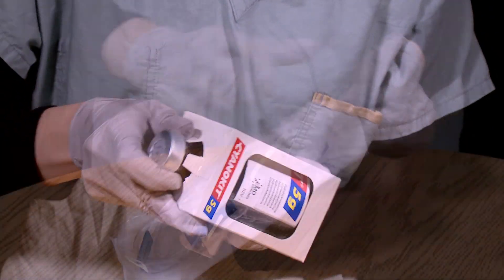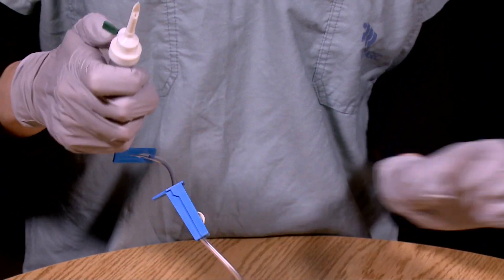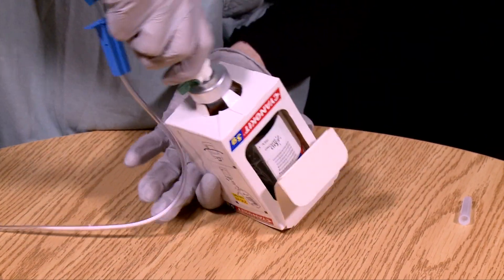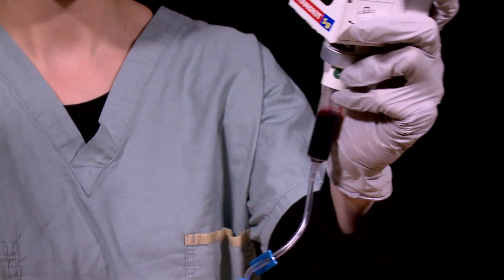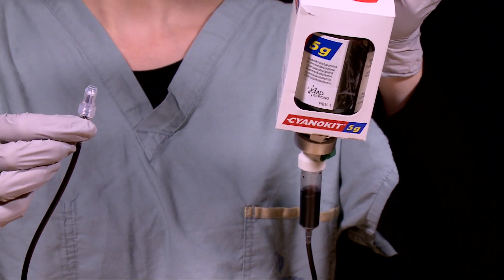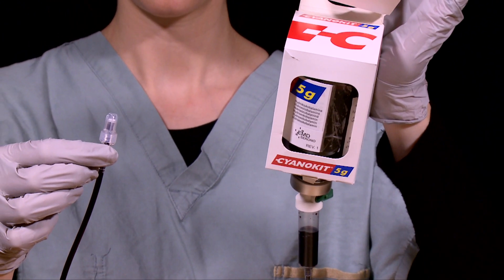Return the reconstituted vial of hydroxocobalamin to the cardboard box that had surrounded the vial. Remove the sterile intravenous infusion set from its packaging and, using the infusion set's intravenous spike, spike the rubber stopper of the vial. If possible, try to use the same entry site used during reconstitution — this will help prevent leakage from the site used with the double-sided transfer spike. Fill the tubing from the infusion set with the reconstituted solution. You are now ready to administer the antidote to the patient. Note that the intravenous infusion set tubing provided in the cyanokit may not be compatible with some smart pumps — if this is the case, the antidote should be administered by gravity.